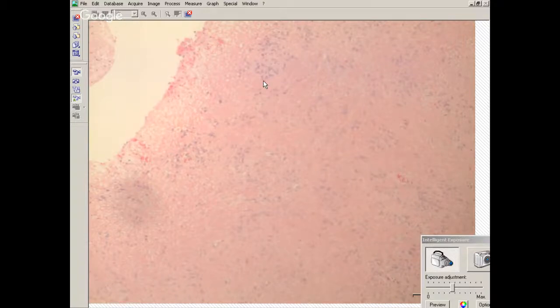And just like the one that I showed you from the autopsy, that's what they look like. There's no markers that are going to end up saying, this is a subependymoma. You have to know the histology and have to know what it looks like to make the diagnosis of a subependymoma. This is a subependymoma.